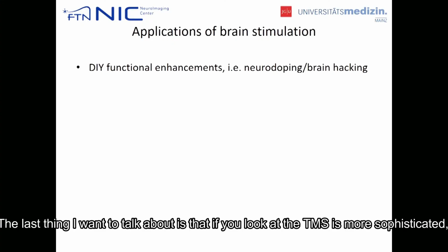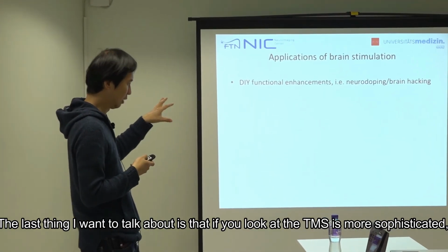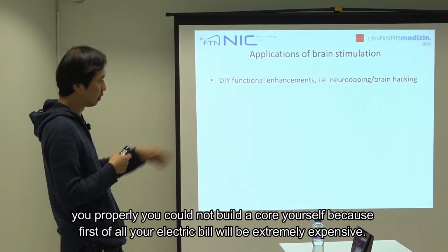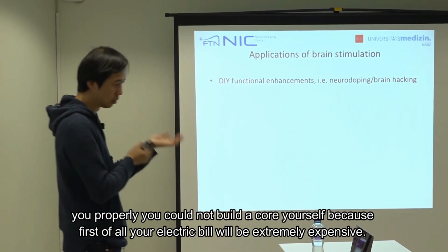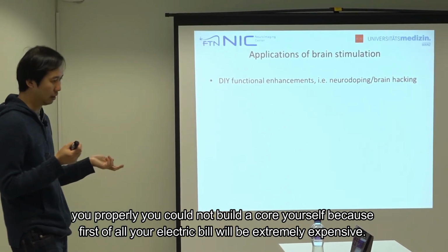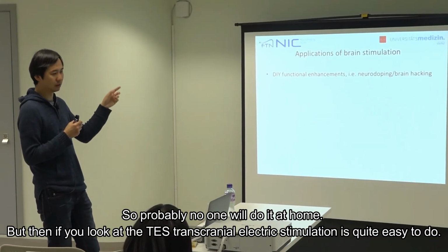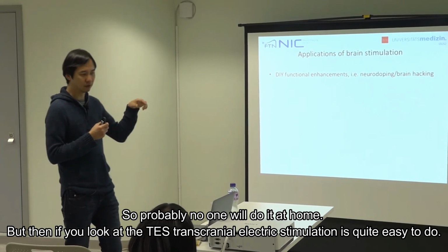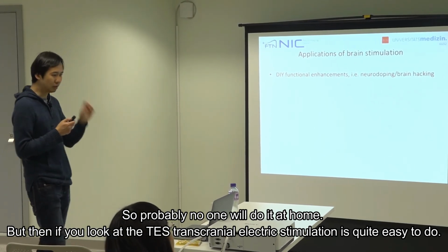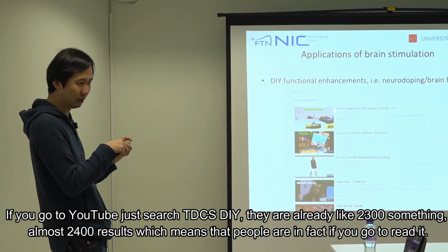And the last thing I want to talk about is that the TMS is more sophisticated. You probably couldn't build a coil yourself because, first of all, your electric bill will be extremely expensive, so probably no one will do it at home. But if you look at the TES, the transcranial electric stimulation, it's quite easy to do. If you go to YouTube, just search TDCS DIY.